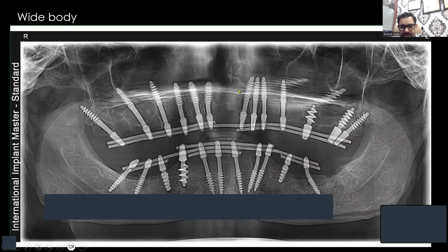This is nasal floor anterior region में. एंड पीछे आपका टेरिगोइड एंगेजमेंट. लोअर में इंटरफोरामिना में आपके एंगेज्ड है, लिंगुअल कॉर्टिकल एंगेज्ड.